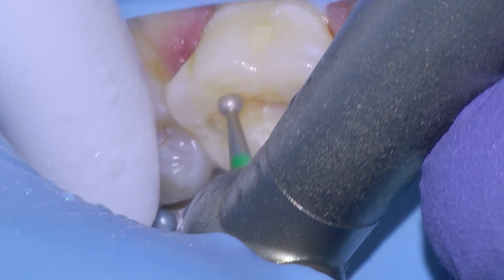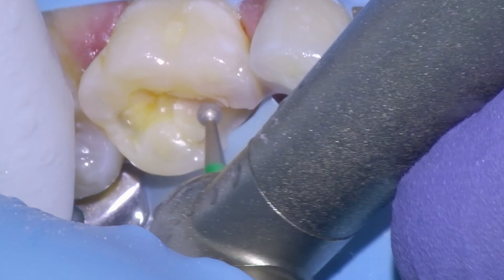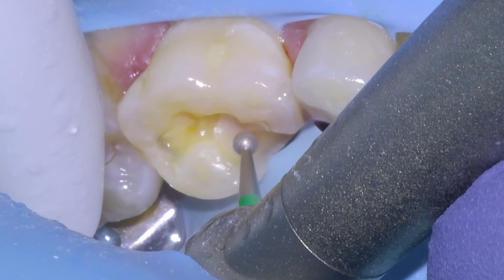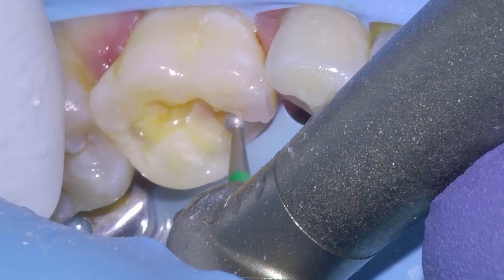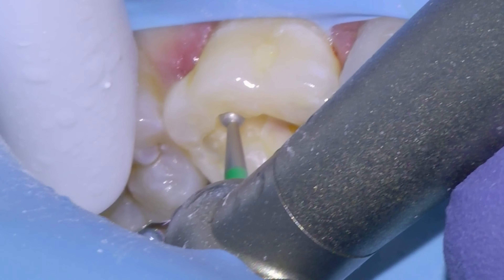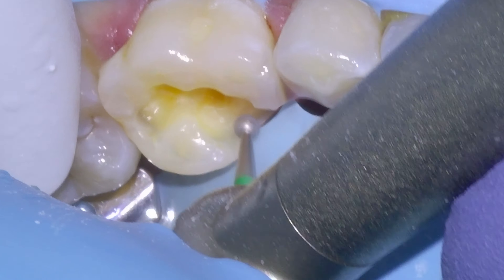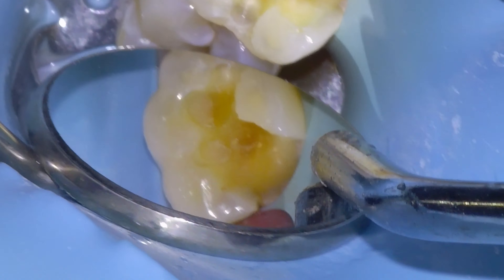We're going to remove the old filling, taking care not to drill away any natural tooth that we don't need to. I'll just take a moment to say that I know I haven't really been posting many videos to this channel — I have a lot of content waiting to be produced, but it actually takes a lot of time and effort to edit and produce these videos, so I will get to it at some point.